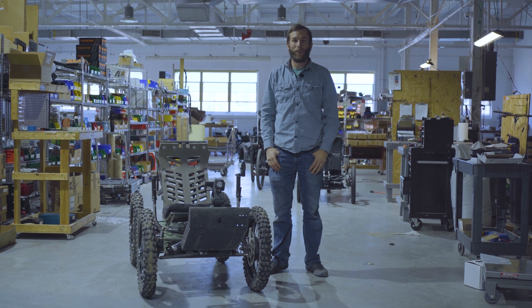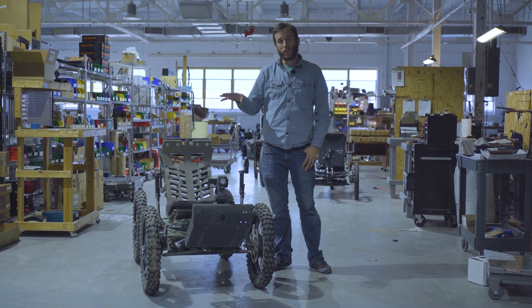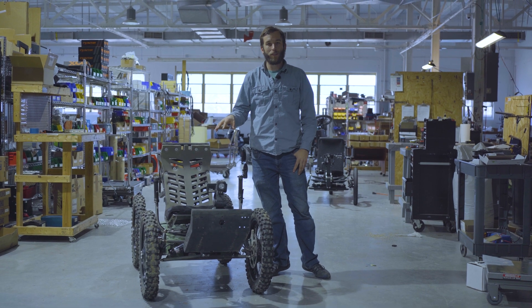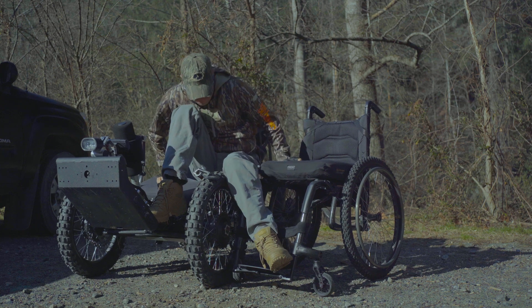Everyone, Tommy here with Outrider USA — hope you're doing well today. We're just going to go over what it looks like to transfer into the Outrider Coyote from a wheelchair. We got a little bit of footage to show what that looks like, and we're just going to talk about what you need to do to prepare to transfer.